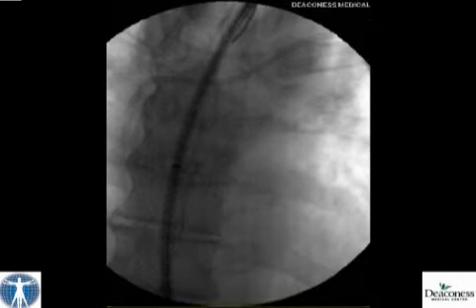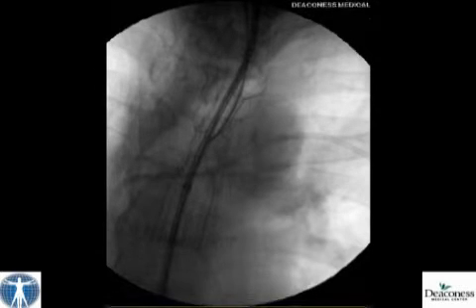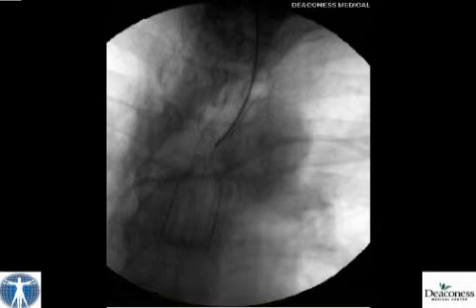This case illustrates how complete esophageal obstruction can be managed by endoscopic interventions, but also, more importantly, it reminds us that prophylactic placement of removable plastic stents should be considered in patients with advanced tumor strictures prior to chemotherapy and radiation.